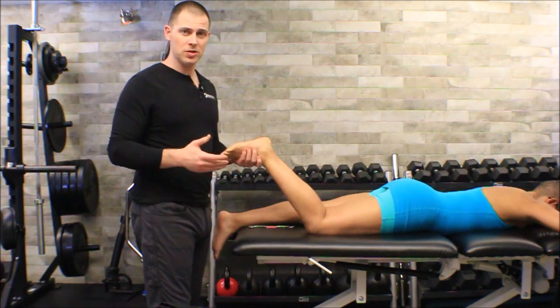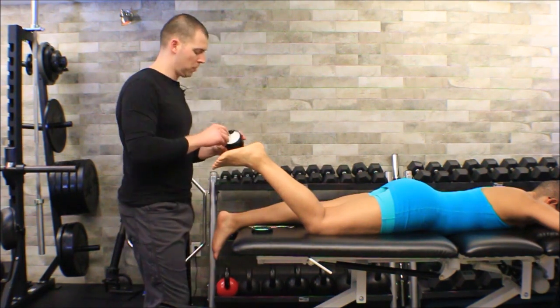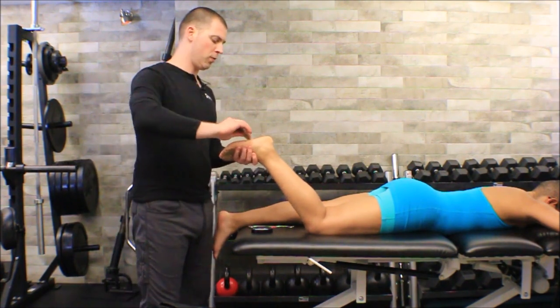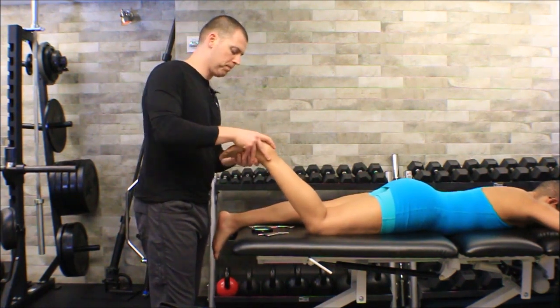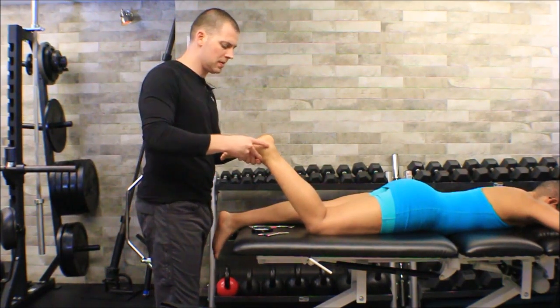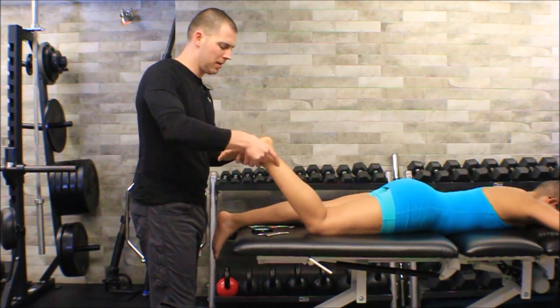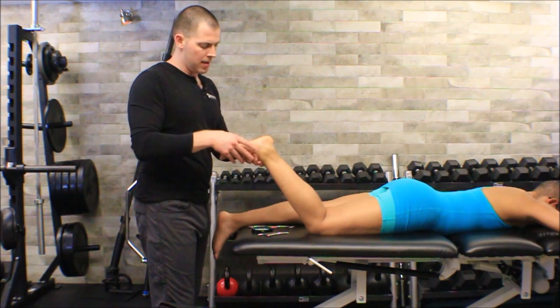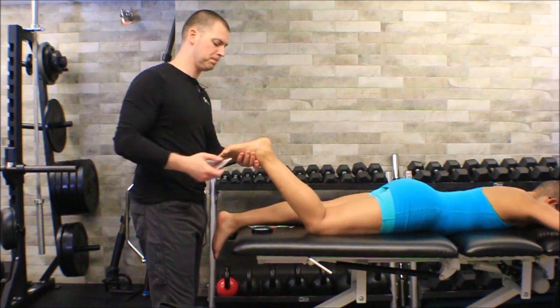So usually I'll start in this position to do these techniques. We're going to go ahead and use a little bit of our Smart Tools cream here. Right? We don't want to run through the skin before we affect the fascial tissue. Again, I can rub that in with my fingers and feel if there's any particular points where I think there's an increase in tissue density or abnormal tension, or maybe even my patient being abnormally sensitive in an area. One of the responses we definitely get from these IASTM techniques is some desensitization, right? Altered afferentation, which might decrease pain a little bit.